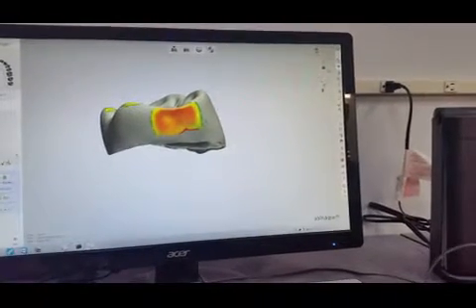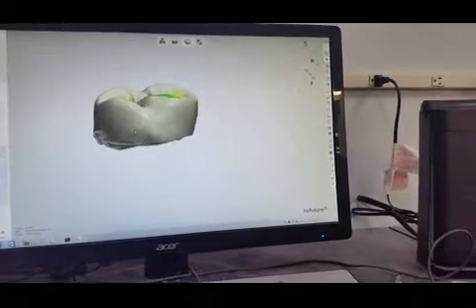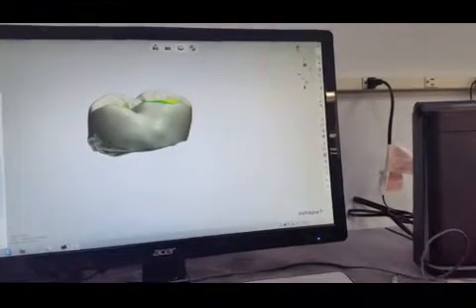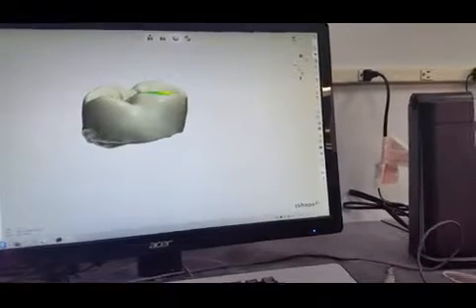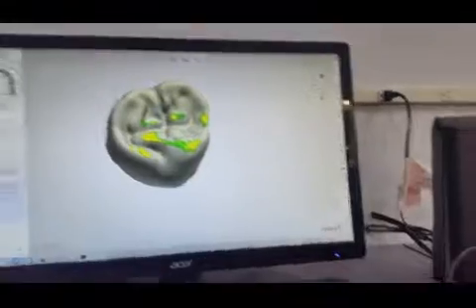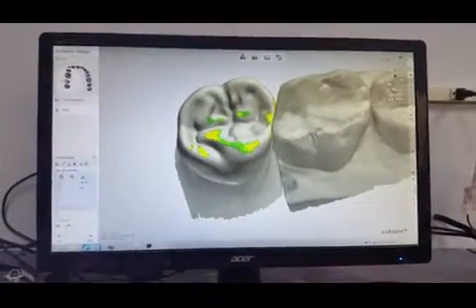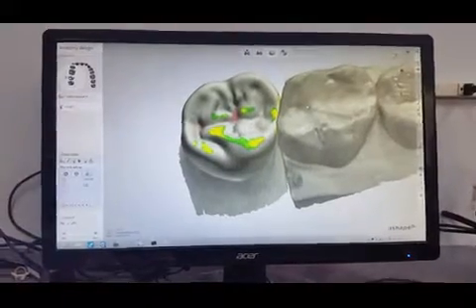I like to beef up this area a little bit. And then just go back and smooth that. And that's pretty much it. That's all we got to work with, really, because of the not so much occlusal clearance.